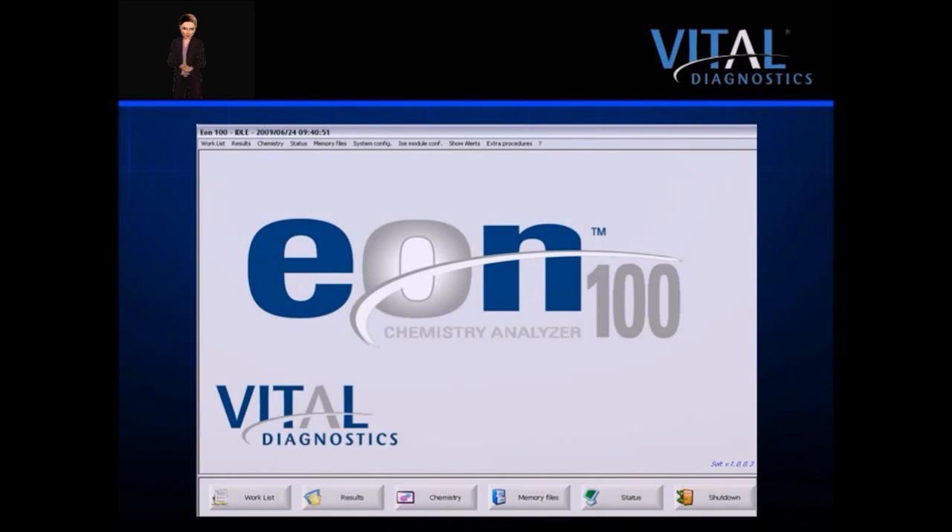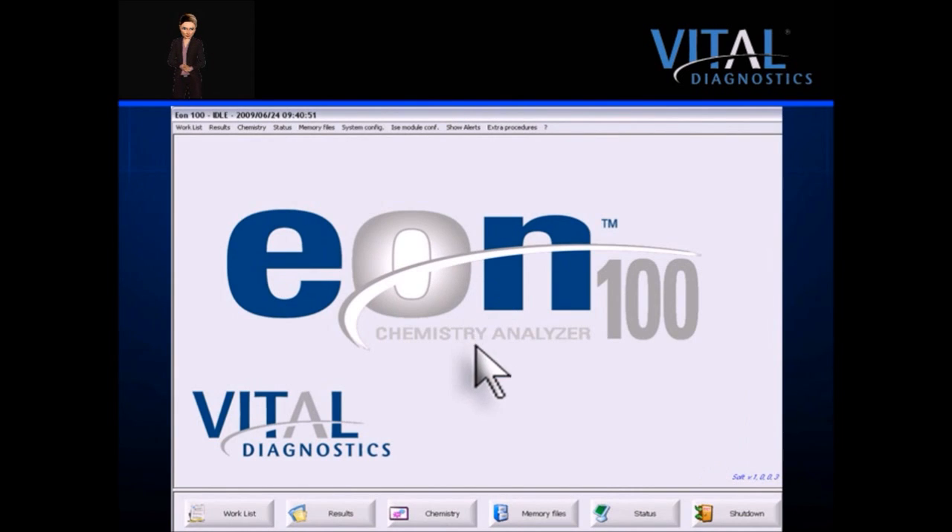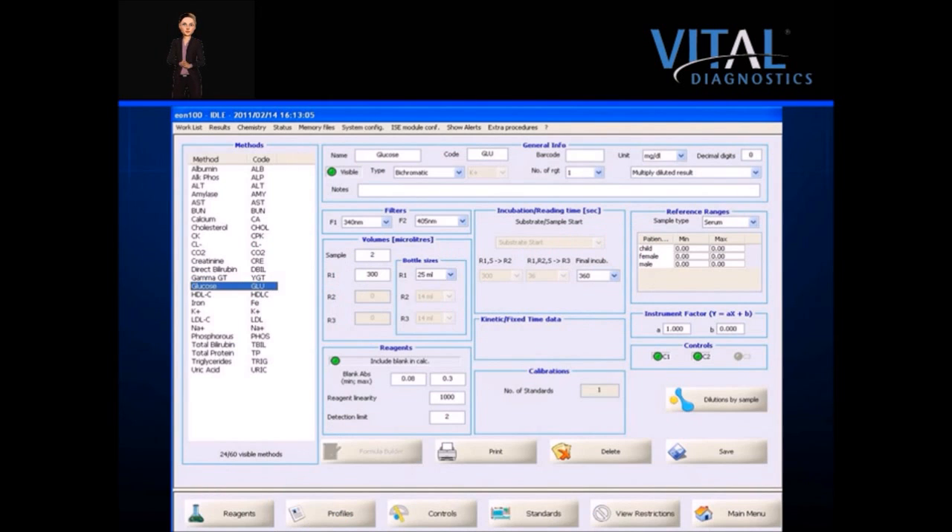The chemistry menu is where reagents are managed, test applications are stored, and profiles are configured. Controls, calibrator set points, and reference ranges are programmed in this menu. Information can be viewed, stored, printed, or modified by one click. The system features restricted access by user to help protect vital information; users with administrator access only will be admitted to certain screens.